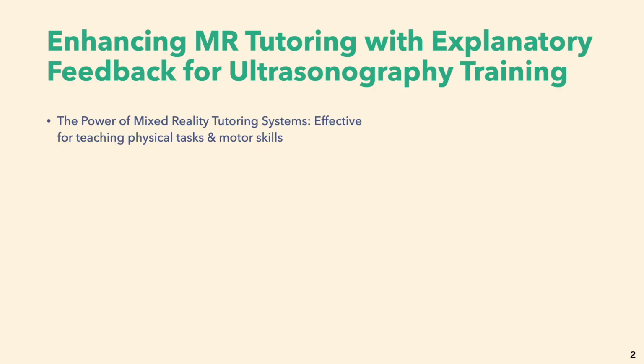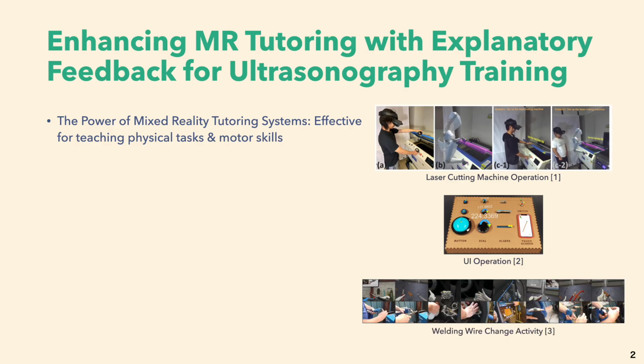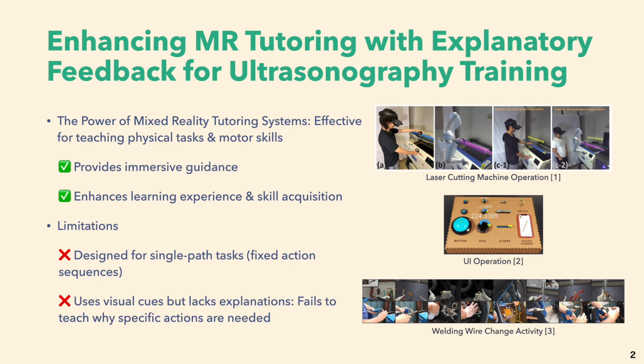Mixed reality tutoring has been proven highly effective for teaching physical tasks and motor skills such as machine operation, UI operation, and welding. By providing immersive guidance, MR enhances both the learning experience and skill acquisition. However, most existing MR systems are designed for single-path tasks where learners follow a fixed sequence of actions. While these systems use visual cues for motion guidance, they often lack explanations for why specific actions are recommended. This gap in explanatory feedback makes the current systems limited in ultrasonography training.